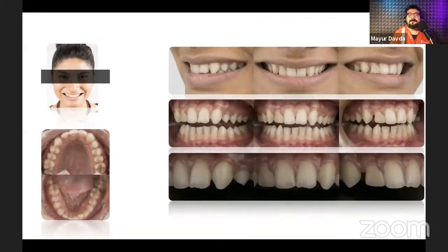So you can see these particular images where I'm going to be putting an arrow. It requires a different set of cheek retractors which are not useful for other images. So you need to have something called 2C-shaped cheek retractors for these images, because of which the image documentation becomes very, very simple.